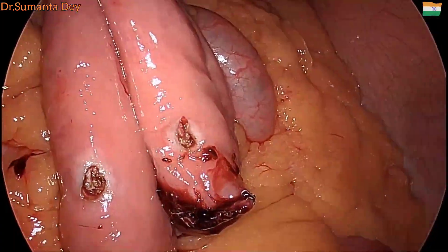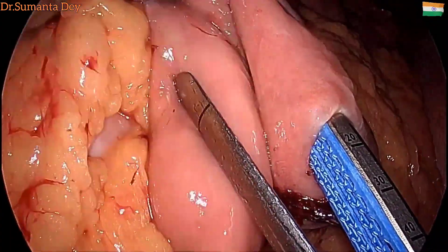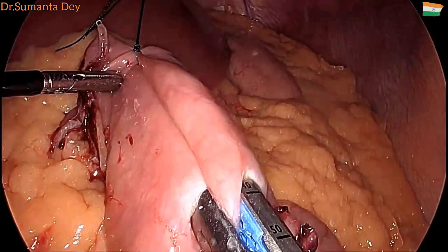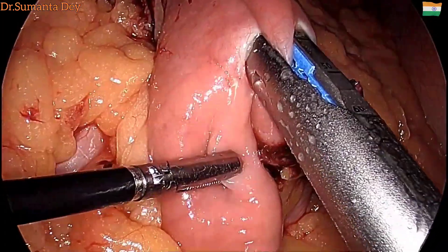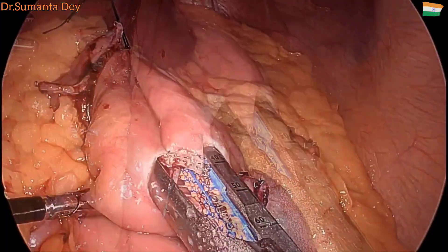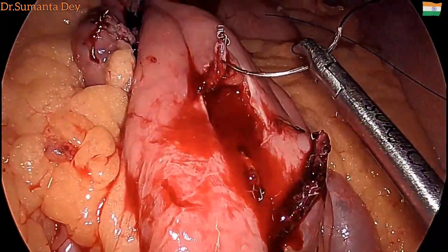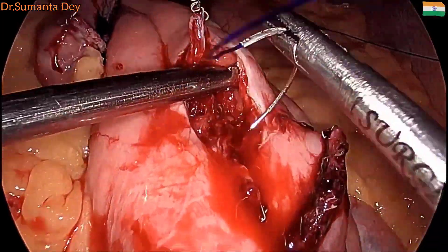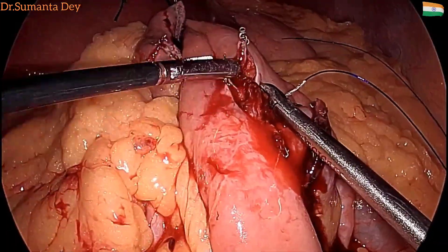You can see I am just dilating the hole, and then again using the 60mm blue load. Once it is done, the side-to-side anastomosis is performed — waiting for one minute — and as we are done, there was a bleeding from the posterior staple line, a spurting bleed.